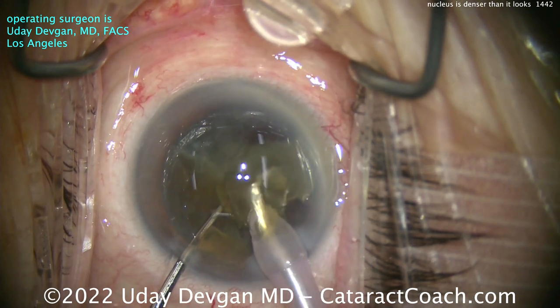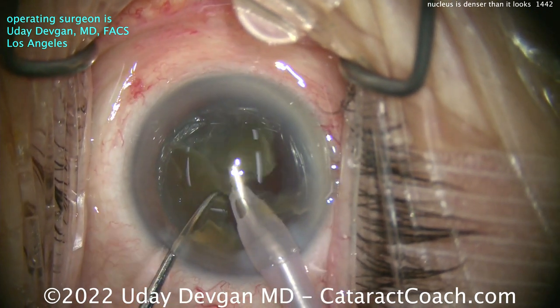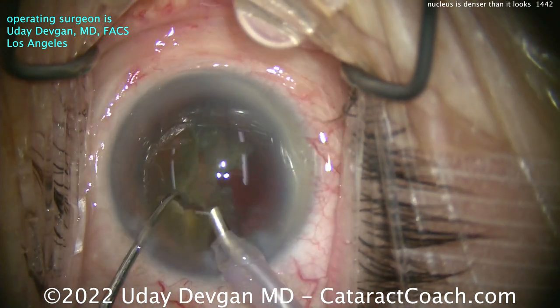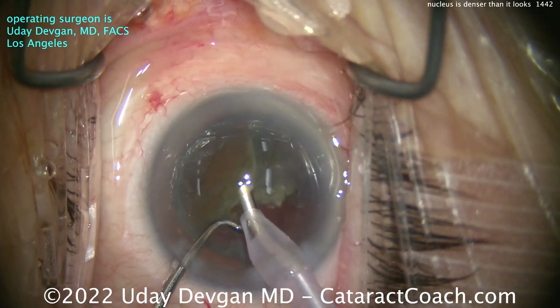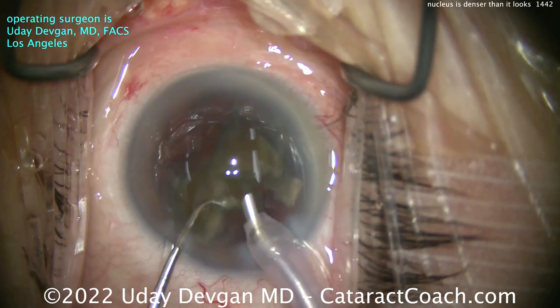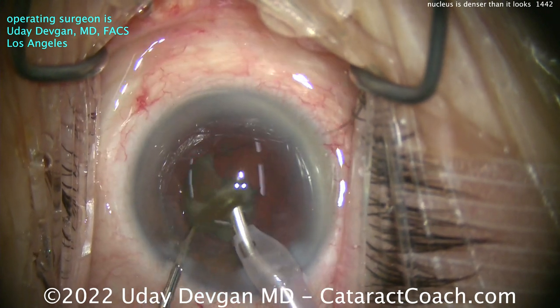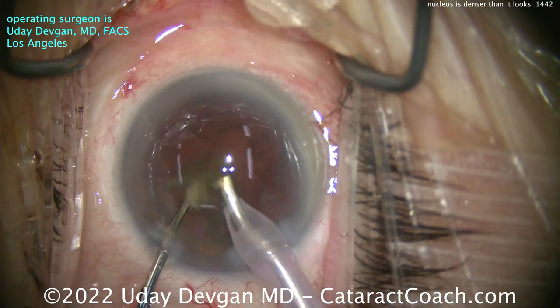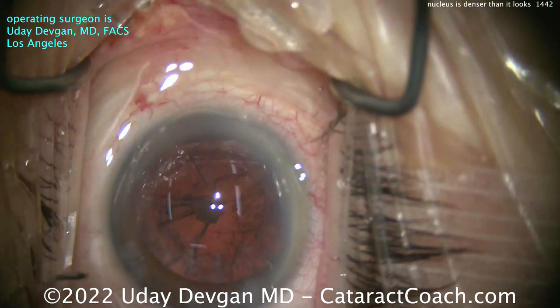Interestingly, in the pre-op visit for this patient, it did not appear to be too dense a cataract. It's only during the procedure that we realize it has more density than expected. Not a big surprise for me — I'm used to doing these kinds of cases. But you can see it's really changing my technique. Normally I would have done just one single chop to get two heminuclear pieces and emulsify each piece. But here I've chosen to slow down and sub-chop each half into smaller fragments.